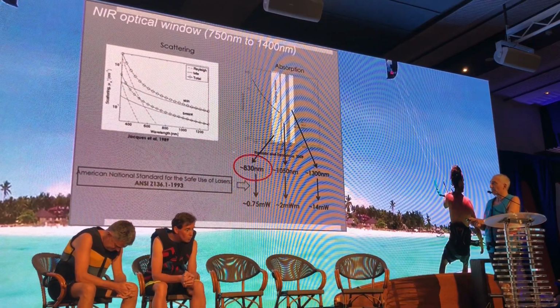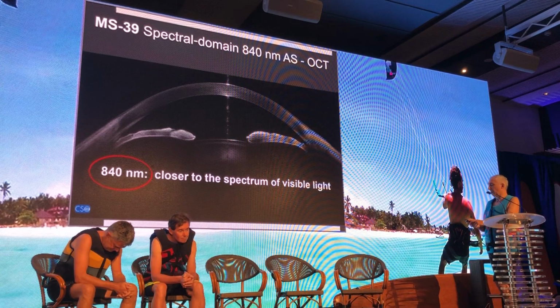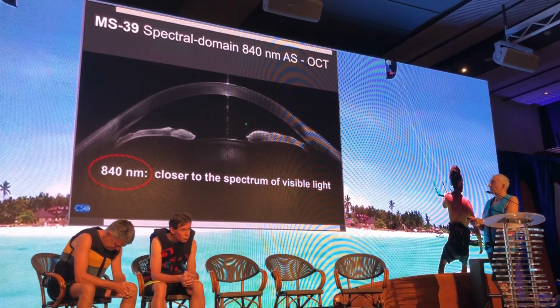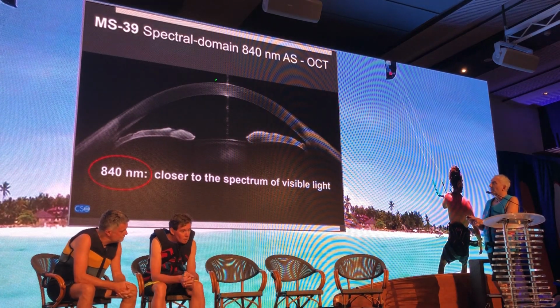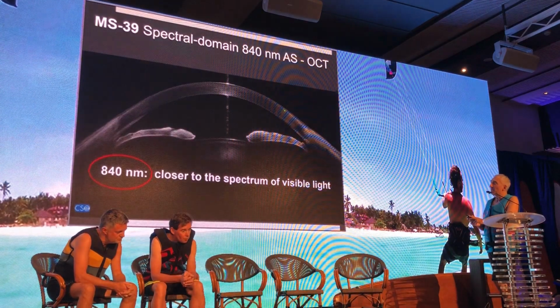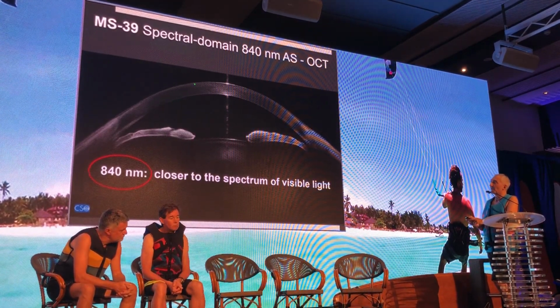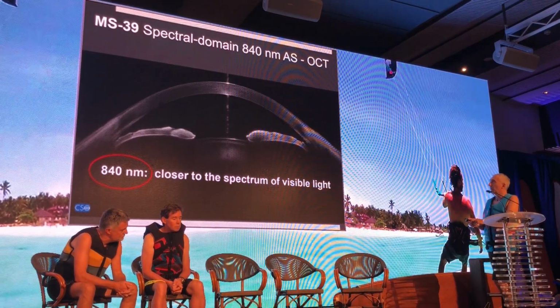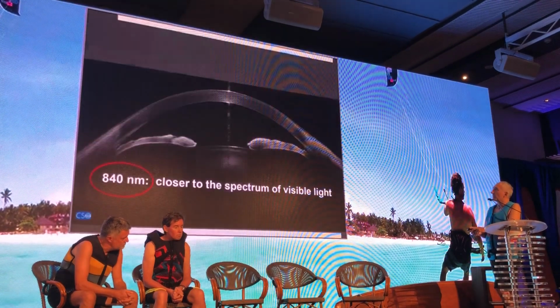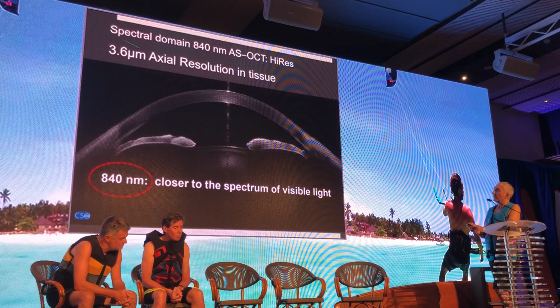This is much closer to visible light, and this also has very good advantages for our work, because you get higher resolution, and being closer to the visible light, any minimal thing that is there in the cornea that is not transparent, you will see very, very well. And you see the level of detail is really better. The resolution is that high.